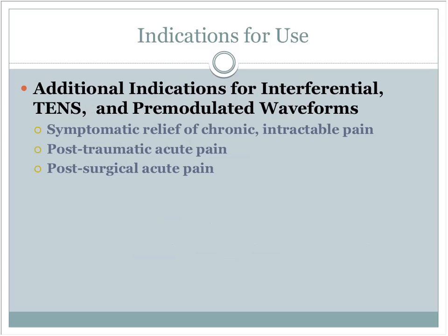But if somebody comes in with fibromyalgia and they've got this intractable pain going on, maybe up in their shoulder blade area, because it really doesn't work on that general sense of discomfort, because you can't put TENS on the entire body. But if you have an area that you can target with it, you may be able to decrease a lot of the pain for that area so that they can exercise. Fibromyalgia responds best to aerobic activity, actually. They need to move to make it better in the long run, but it can be very painful to get moving, and that's where this can really help.